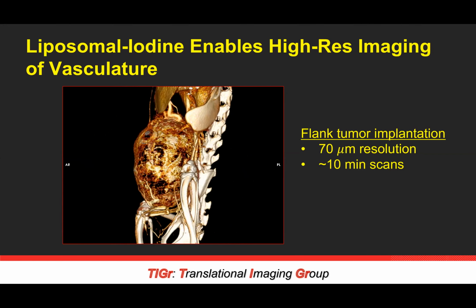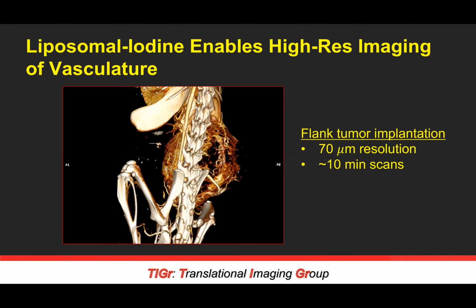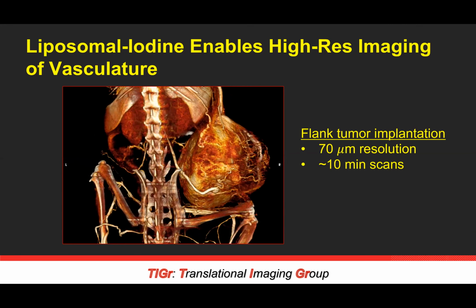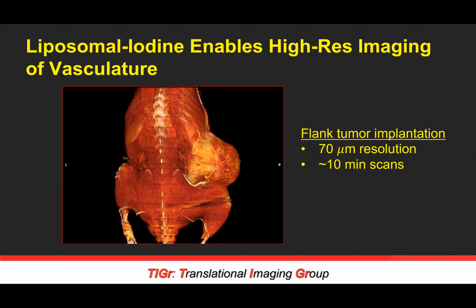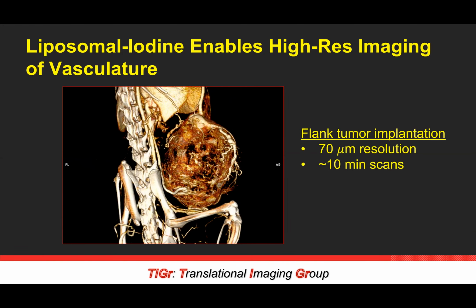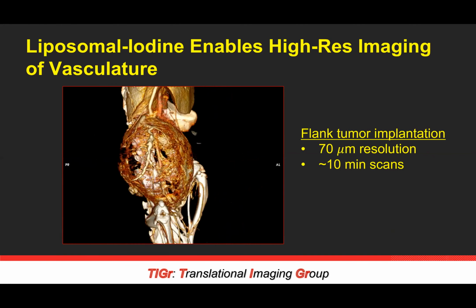This is very interesting data. It's very important to look at for being able to monitor tumor progression, and could be used for future therapies, especially looking at the tumor microenvironment. Note that this is a 70 micron resolution scan, and this is a 10-minute scan protocol.